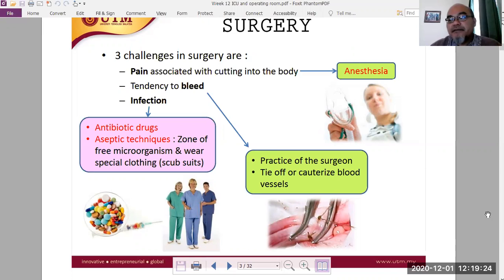in the operating theater. But there is another new trend, which is using robots to conduct the surgery. Most of the popular surgical robots now are called, maybe Kevin knows the name of the surgical robot, the Da Vinci robot. In this case, the surgeon is facing a surgical console, not facing the patient anymore.